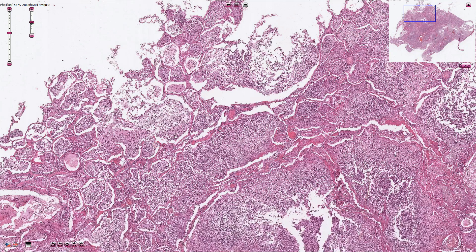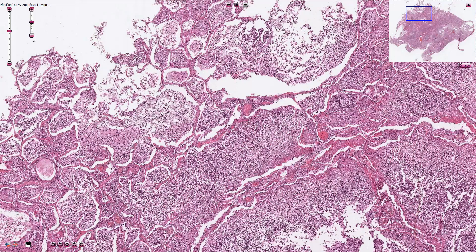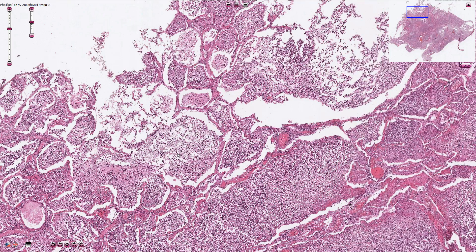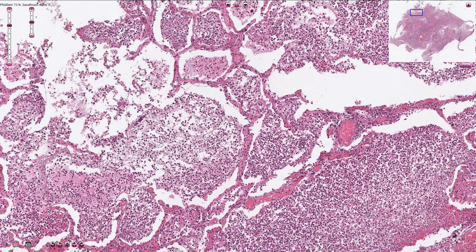It can progress to purulent bronchopneumonia with a lot of neutrophils, as we can see in this case. All of these cells are basically neutrophils, and the thin strands are fibrin, which is also part of the exudate.